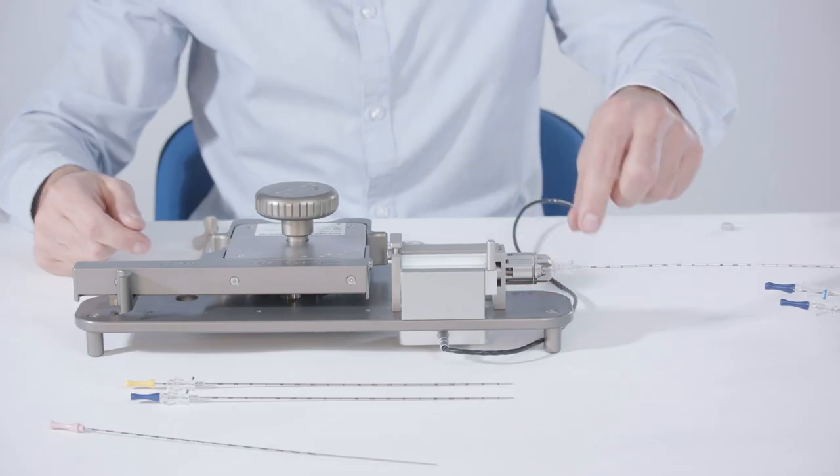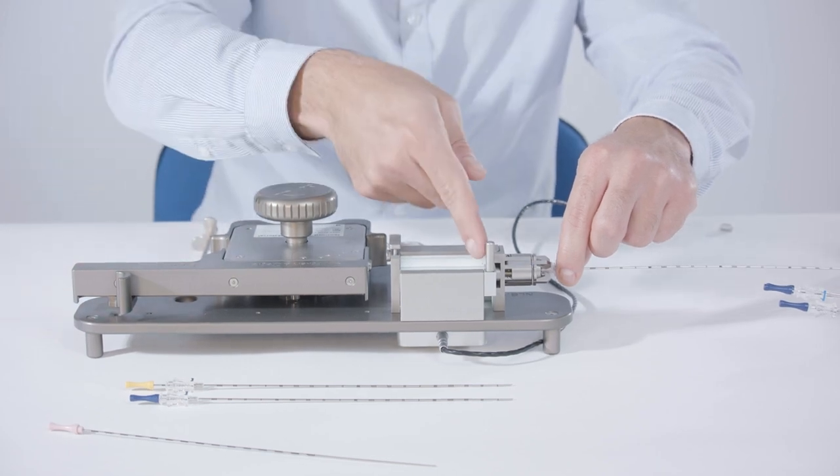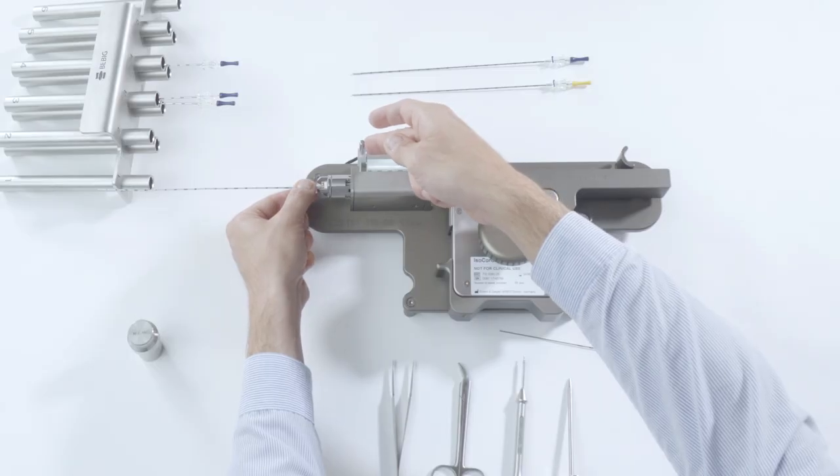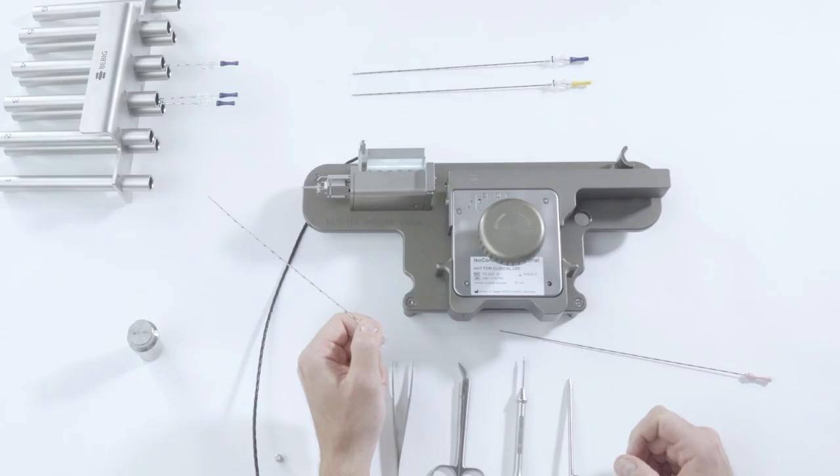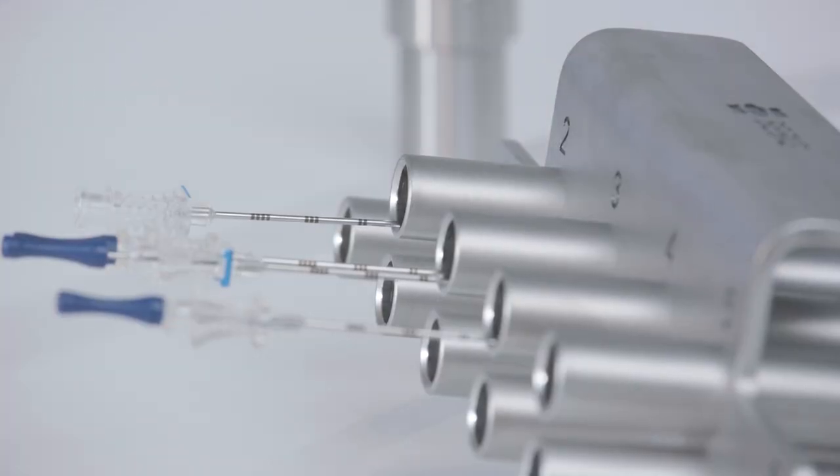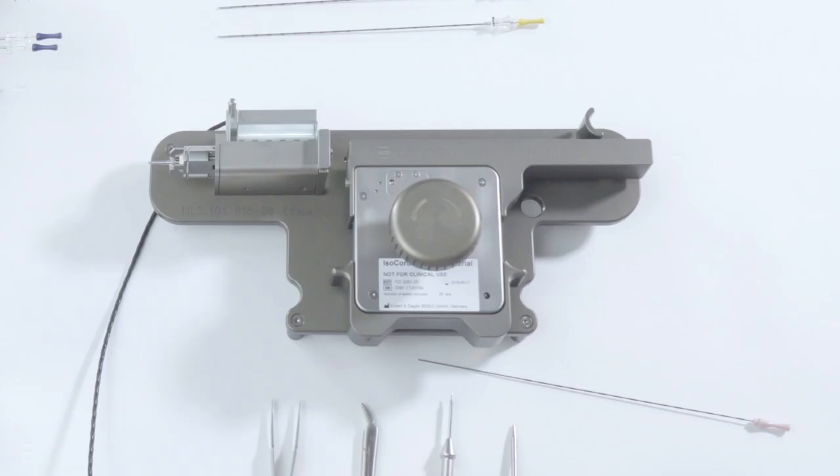You can then remove the needle by grasping the loaded needle by the adapter and activating the unlocking lever on the NLS. You can store the loaded implantation needle in the needle magazine temporarily before starting the treatment or implant directly.